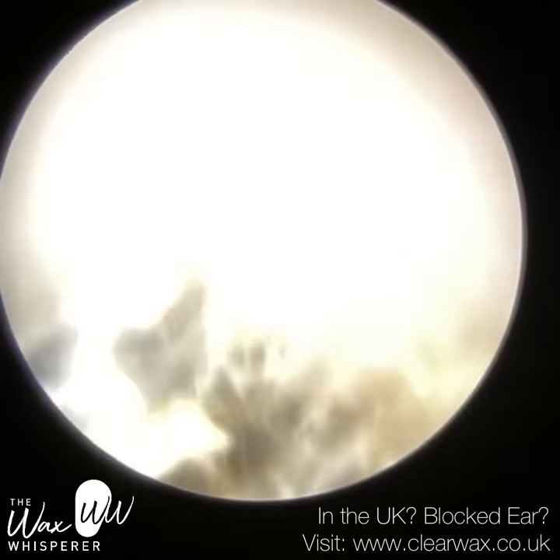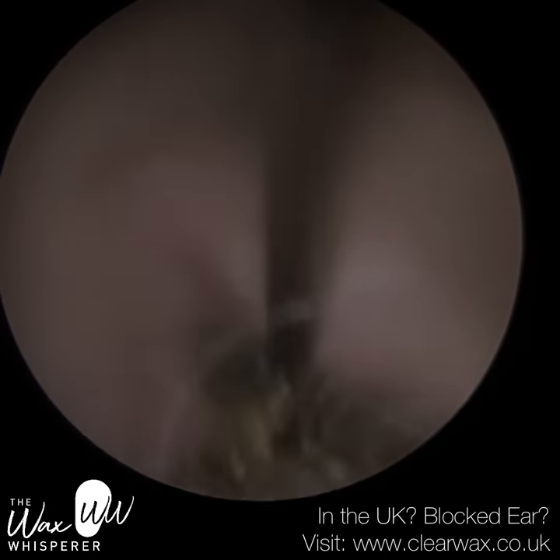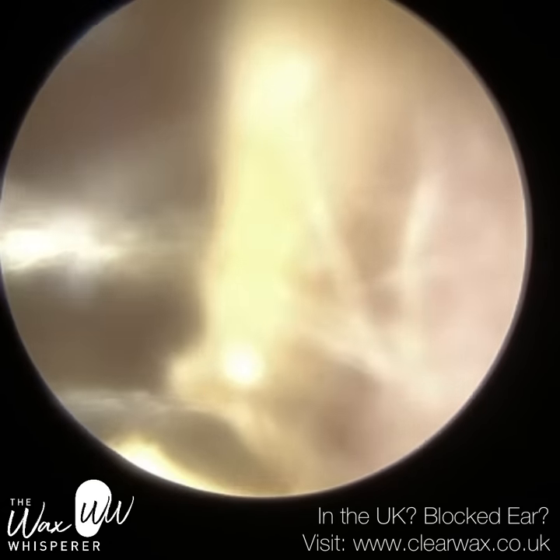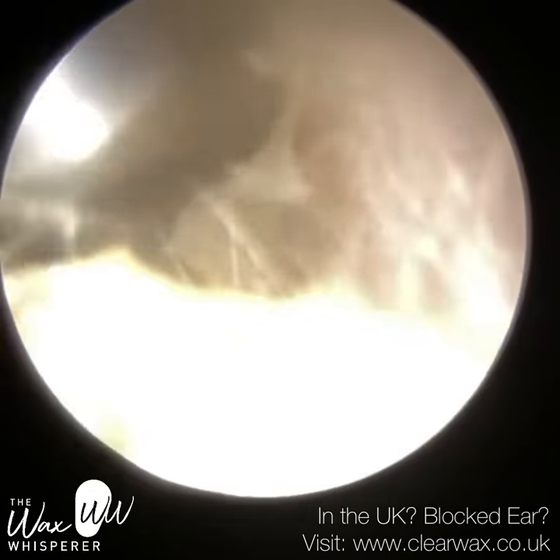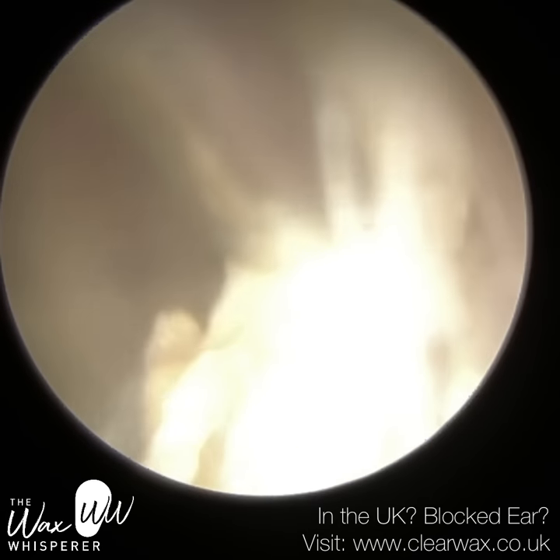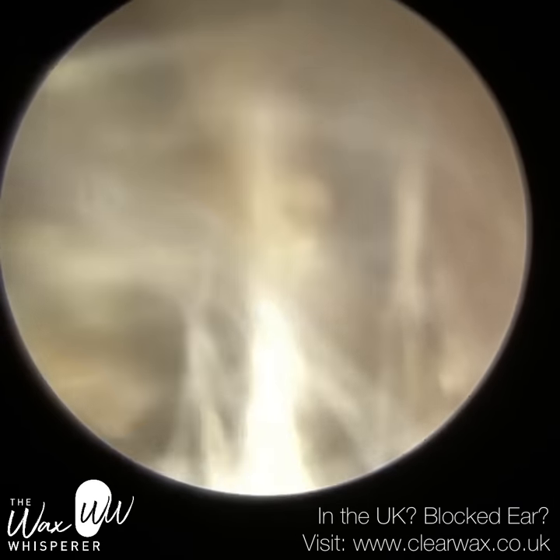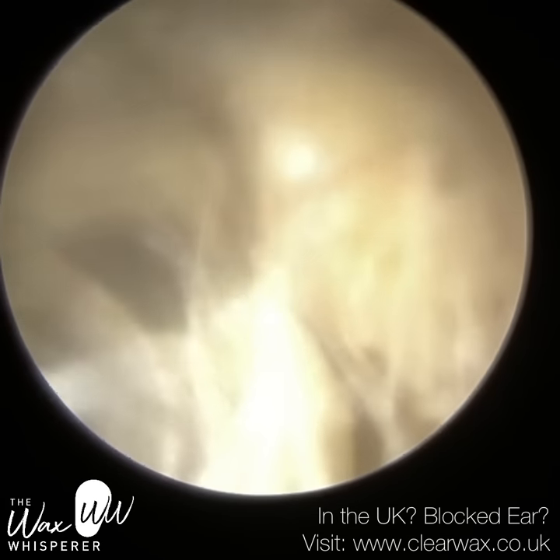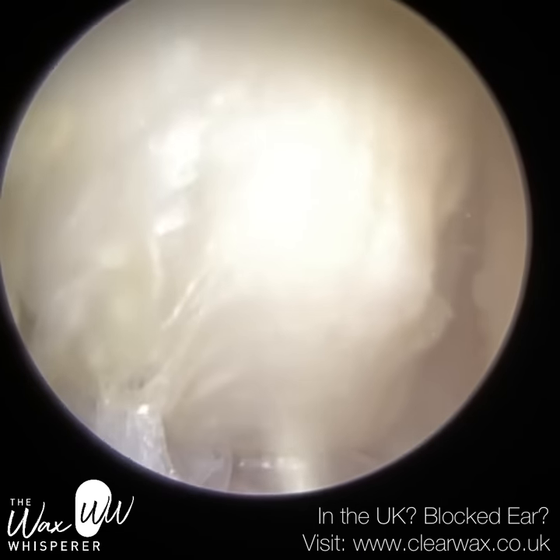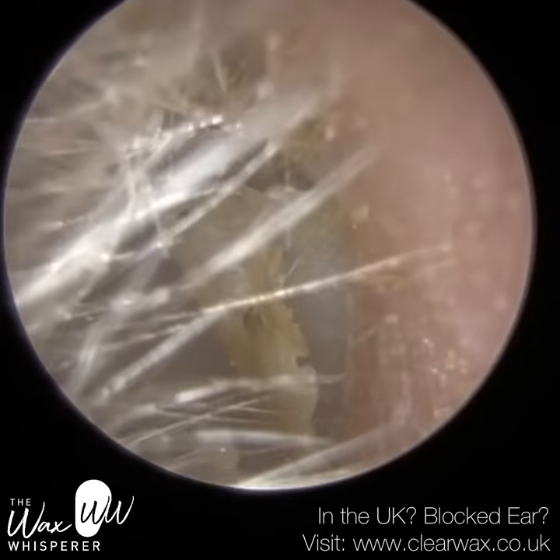With the right ear, this patient's right ear was very hairy at the entrance, and on occasions it was smearing the tip of the endoscope lens — so you can see it was a bit blurry at times. I managed to hook that out. Once more I've got this layer of skin just at the entrance, which I'm just going to peel away. The skin's very dry, and the patient advised that they wash the ears out most days. So this is something I was never made aware of growing up — to avoid water in your ear. It's only once I became an audiologist that I learned through experience that water is not advisable in the ear and it can lead to an infection — swimmer's ear.